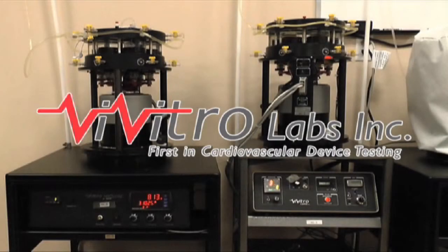If none of these methods seem to be working, please let us know and we'd be happy to troubleshoot the issue with you.